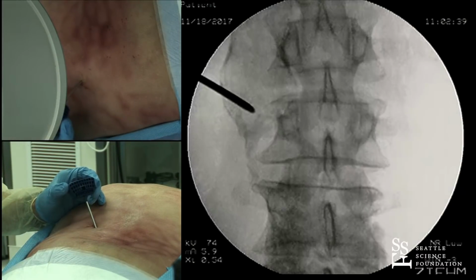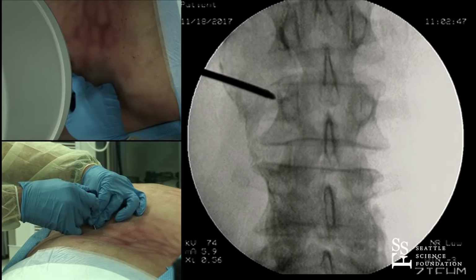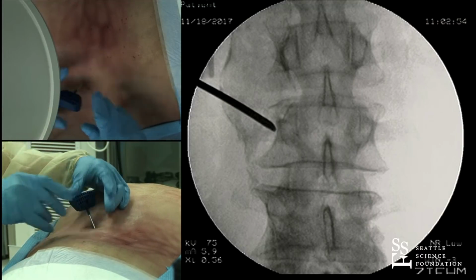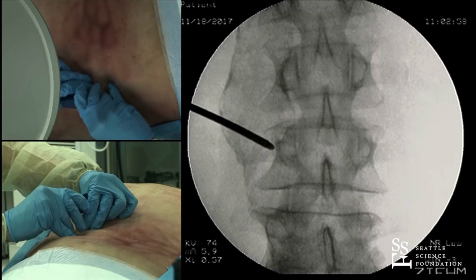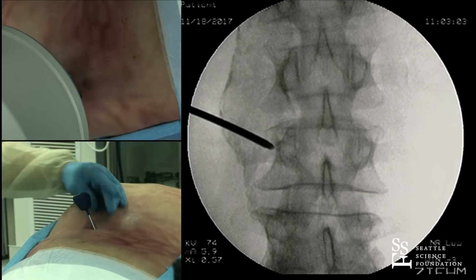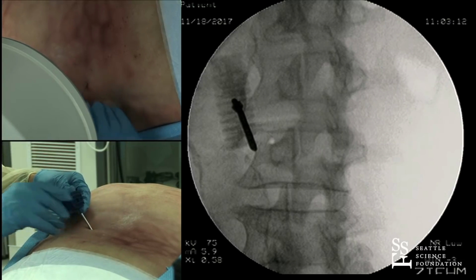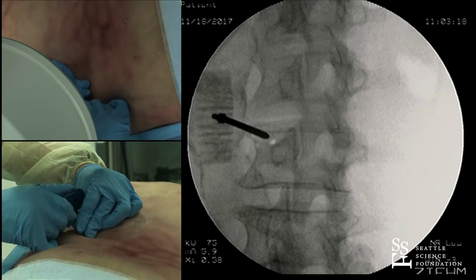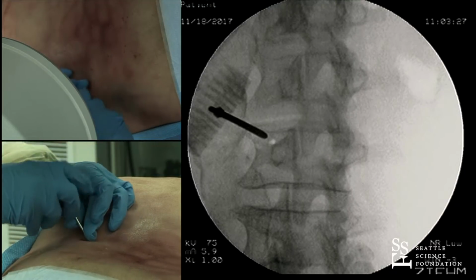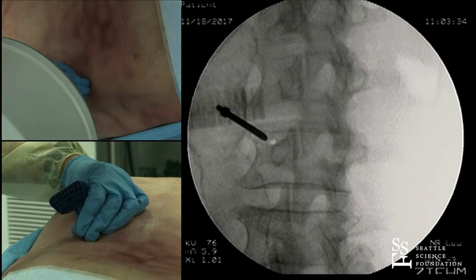We're going to be at the 10 o'clock position just anterior to the pedicle. So right here, what really works very well is to take an ipsilateral oblique about 20 degrees ipsilateral toward me to make sure we're anterior to the pedicle. In fact, we are anterior to the pedicle. I'm going to go a little bit even more posterior. So you want to be right there, right there, just above the equator of the pedicle, just anterior to it.